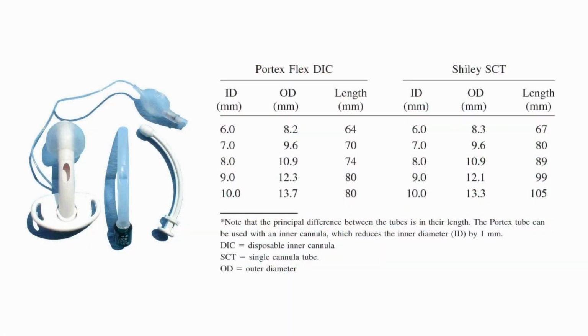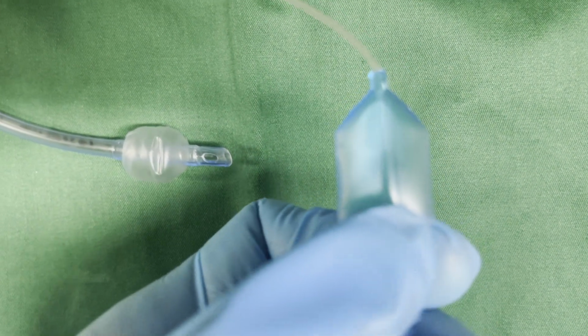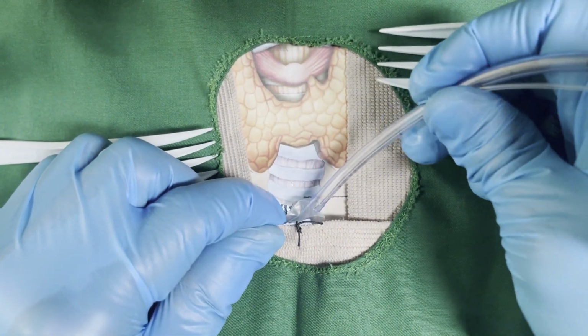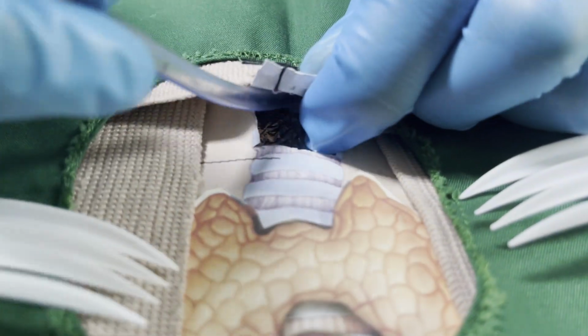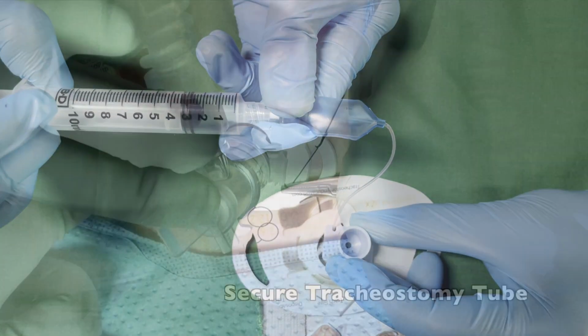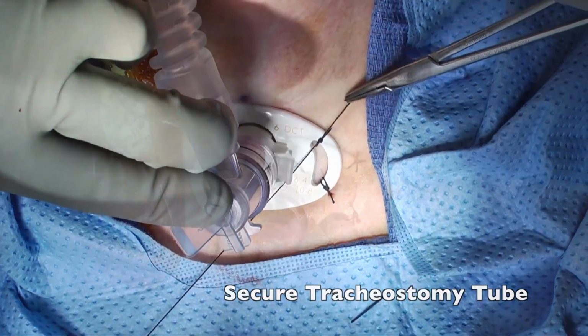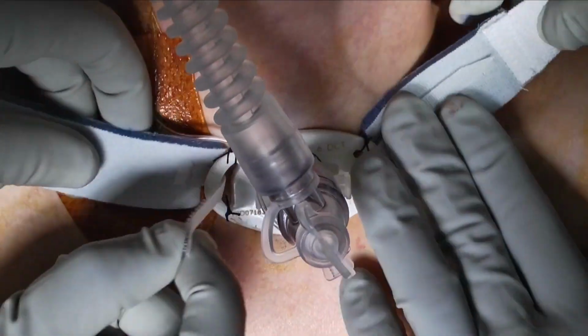Assess the size of the trachea and select the largest cuff tracheostomy tube that comfortably fits the tracheal lumen. Inject air into the inflatable cuff of the tube to test its integrity. Insert the tracheostomy tube into the tracheostomy under direct vision while applying traction to the silk traction suture attached to the tracheal flap. Then, inflate the cuff and attach the anesthetic tubing. The tube may also be sutured to the skin. Secure the flanges of the tracheostomy tube and pass them around the neck. Tie them with a neck flex.